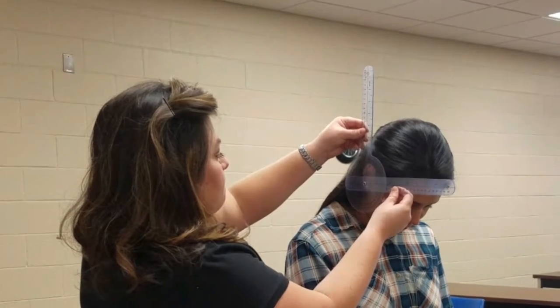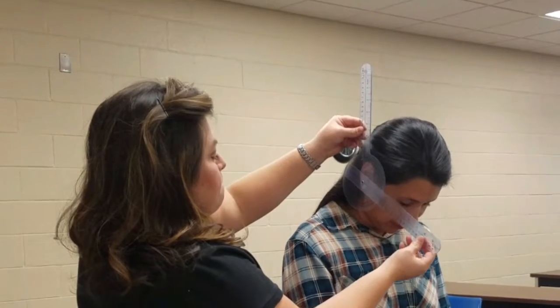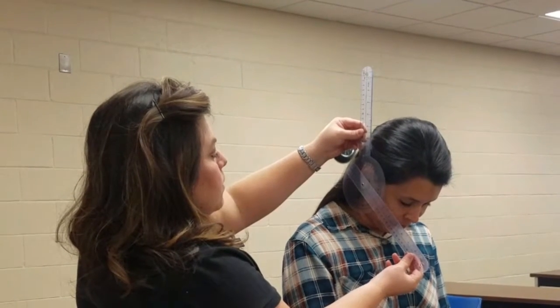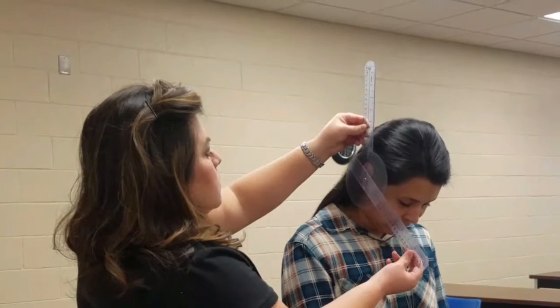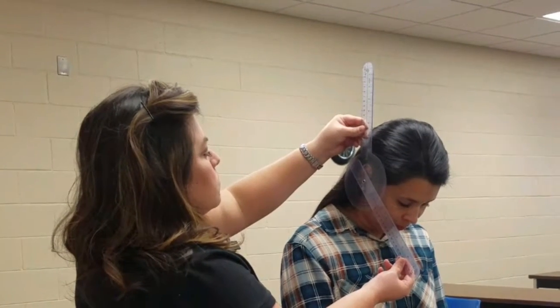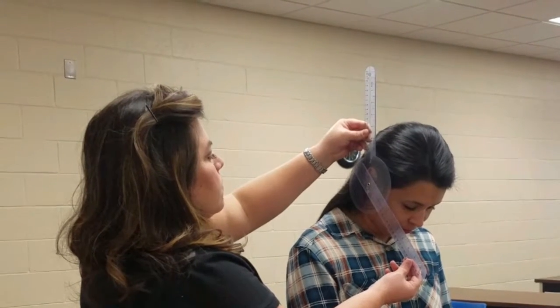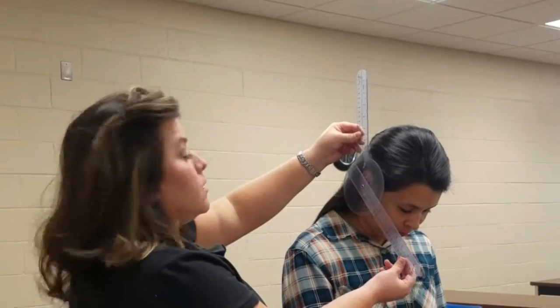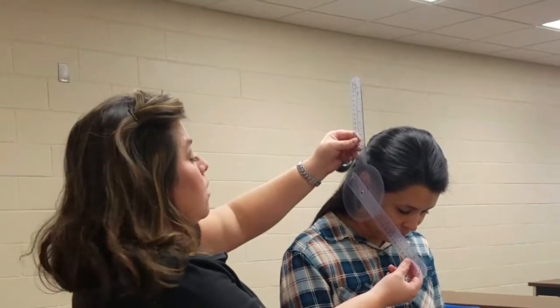Base of the nares. So I have her measured at, hold on just a minute. I've got 60 degrees, no, I'm sorry, that's 50 degrees of cervical flexion.